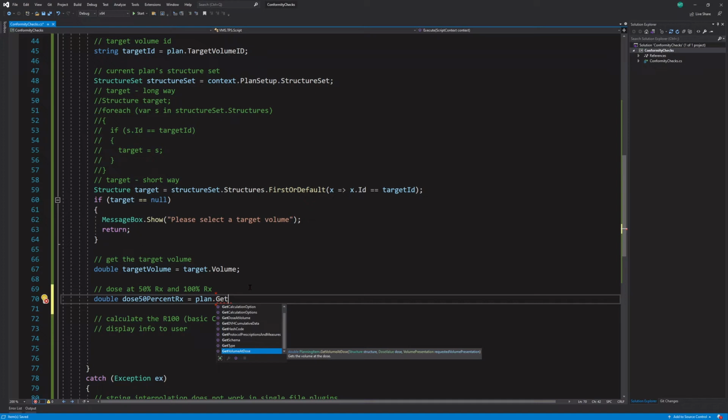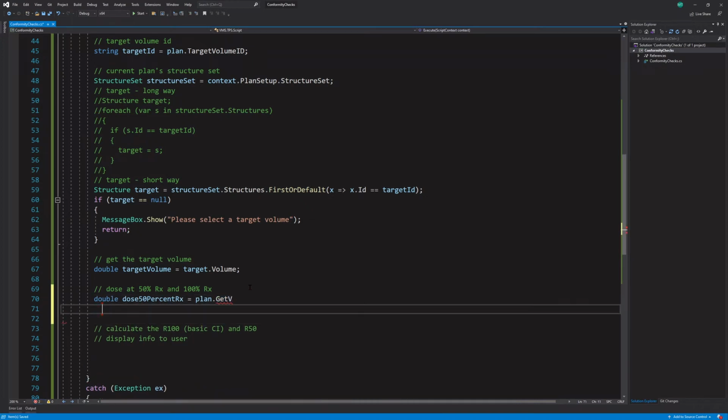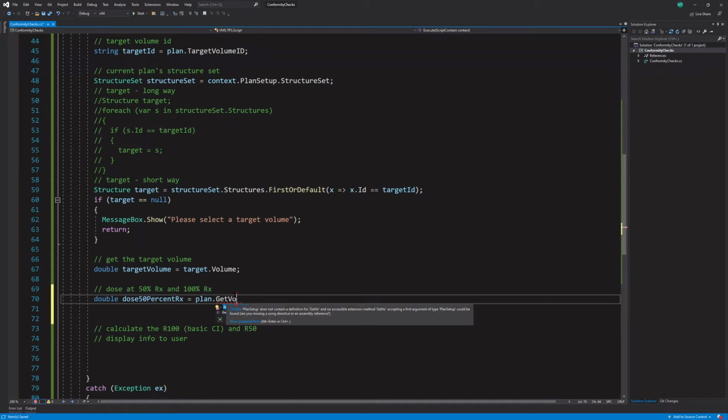So we've got a plan and that has dose, right? We've already checked to make sure there is dose, and we want to get dose at volume. Actually, no, we want to get, what's going on here? Oh, I just had a bunch of spaces highlighted. Okay, so we want to get volume at dose. When I clicked away and was having problems, I lost my IntelliSense. If you lose it and you want to get it back, just hit Control Space, and you'll get it back on whatever letters you've typed. Okay, so we want get volume at dose.